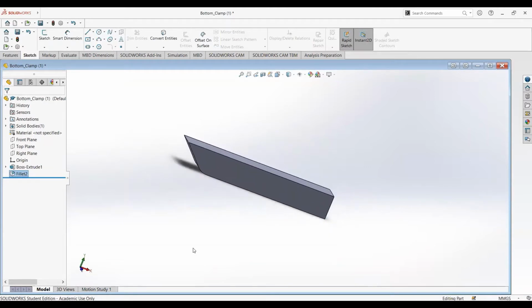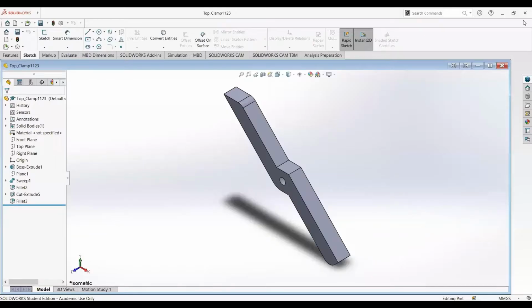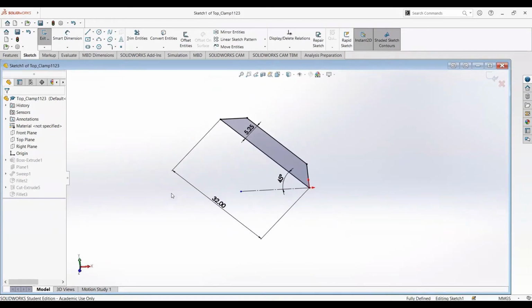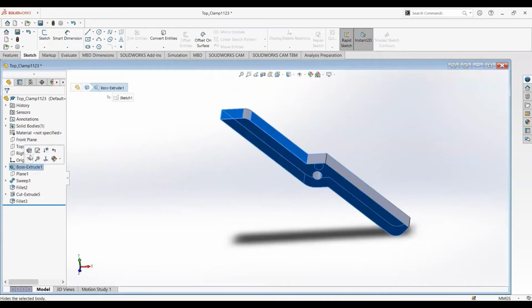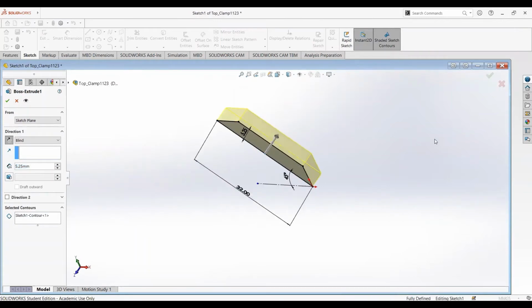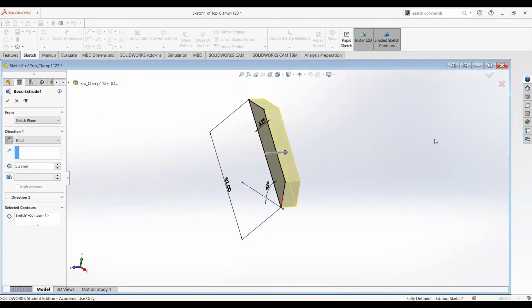Now I'm going to show you how we created our top clamp. This is how it looks. So first, we sketched this. It's like the top portion of the top clamp. These are all the dimensions. And of course, we're going to extrude that. We extruded by 5.25 millimeter, as you can see right here. I'm going to rotate it so you can see.